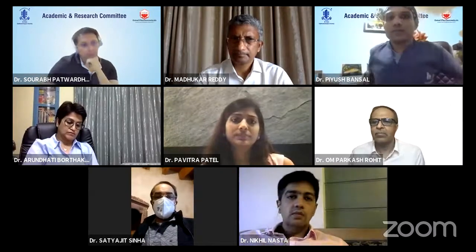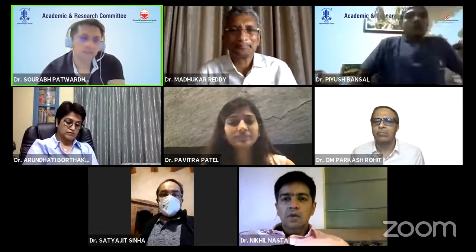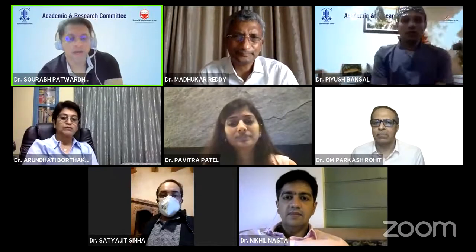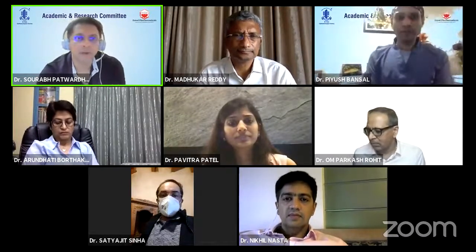Dr. Saurabh, you have anything to add? Dr. Madhukar? I think this is the last video we have seen. So yeah, I think wonderful video. I think most of the technical aspects Dr. Om Prakash sir has rightly pointed out.